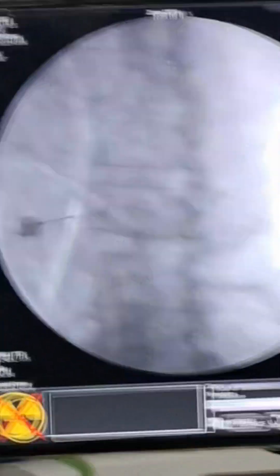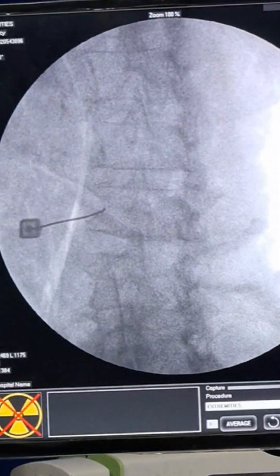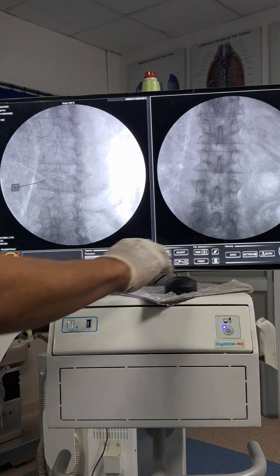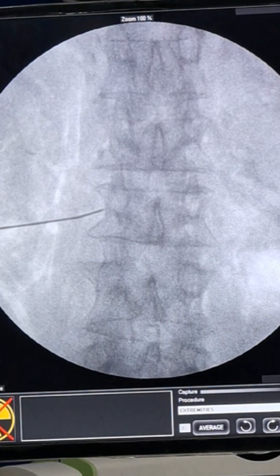At this oblique view, now it is time to take the C-arm to lateral view. But before going to lateral view, always check the AP view first to see how medial you are relative to the vertebral body. I can see the needle is very close to the lateral border of the vertebral body — it is not laterally placed, it is quite medially positioned.